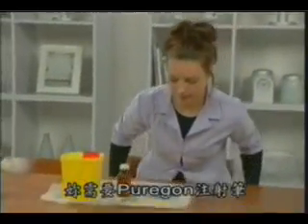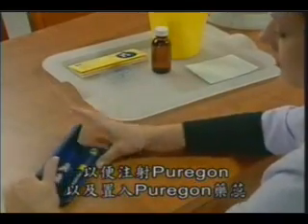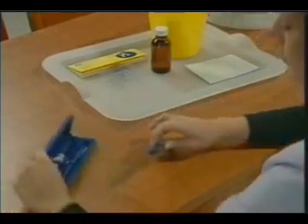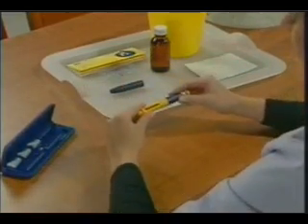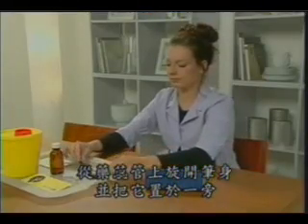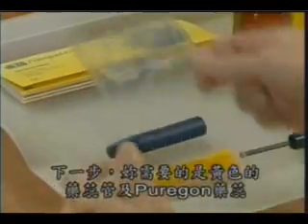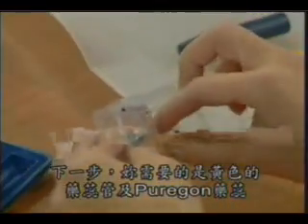At the start of your Puregon treatment, and each time you need to change a Puregon cartridge, you take the Puregon pen. Remove the cap from the pen by pulling it off gently. Unscrew the body from the cartridge holder and put it aside. For the next step, you need the yellow cartridge holder and a Puregon cartridge.